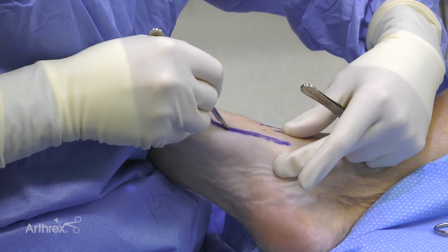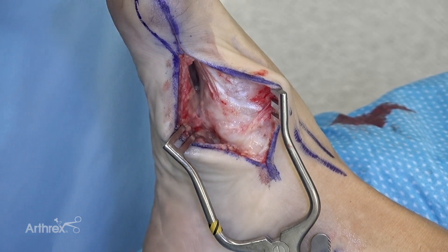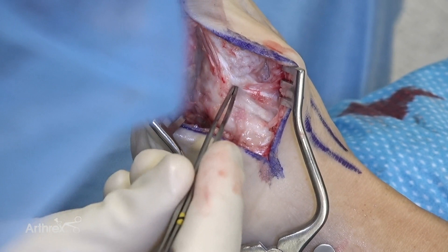When I first start my dissection, I like to find the metatarsal here. I know I'm safe right in this region — I'm away from the tibialis anterior — so I'll make an incision down to bone at the first metatarsal. One of the important things about the plantar lapidus procedure is being cognizant of the tibialis anterior tendon. We can actually see this coming down, and I'm going to reflect off the joint and start to expose it so we can prepare this. You can see the border of the tendon right here, so I can safely remove this to access the joint.